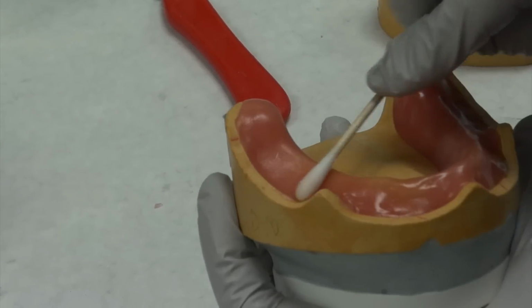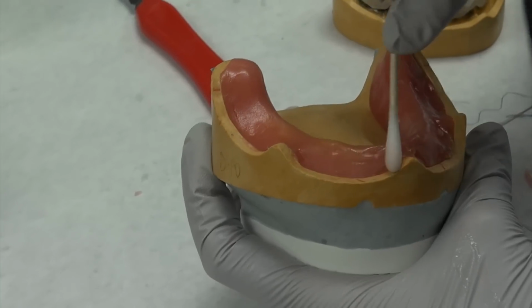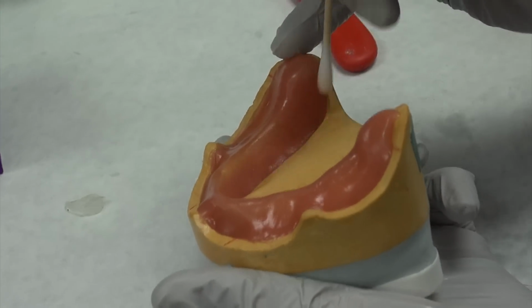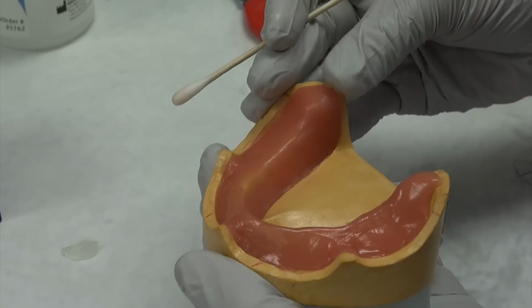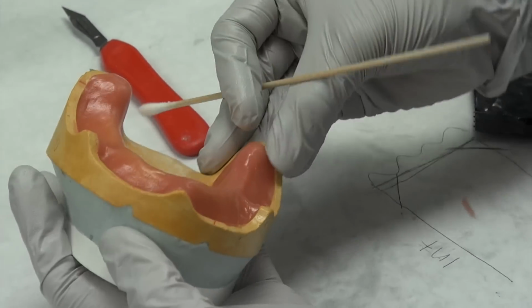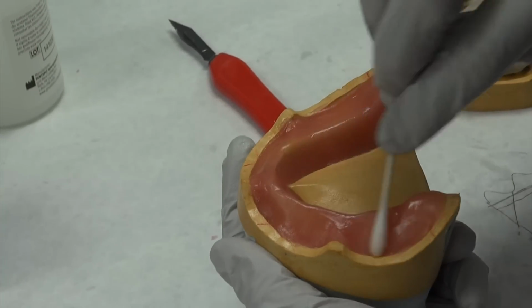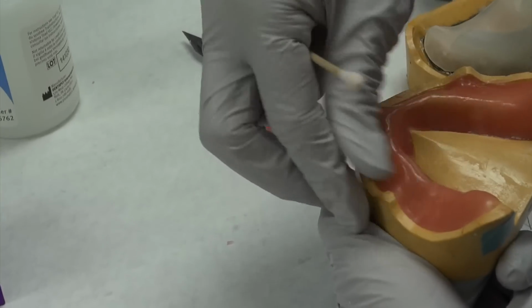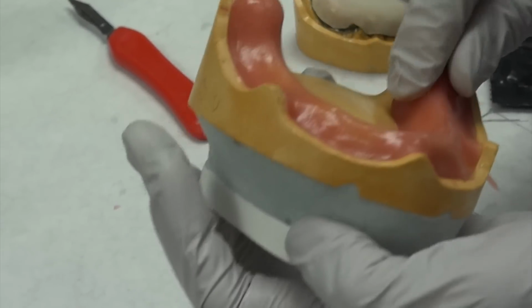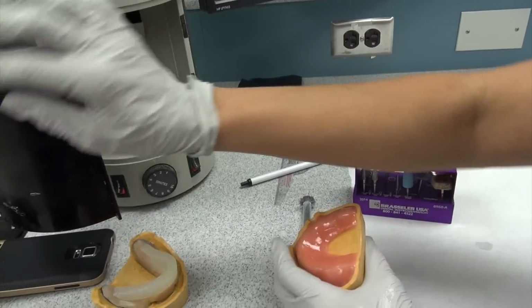Now, the most important thing to take note of is that this area here doesn't get too thin, the shelf, as well as the distal lingual and the retromolar pad. Those areas get thin so easily, so you really have to be very diligent and very purposeful at the very, very end to just come along and double check all of those areas. Okay. And if you think that it's getting too thin, remember you can just pinch it ever so slightly. Now we're going to trade this out.